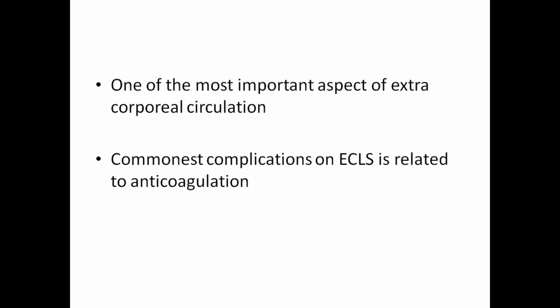And it's one of the most important aspects of the extracorporeal circulation. At the same time, if you're not careful enough, that can cause a lot of problems as well. And the commonest problems on ECMO are related to either over anticoagulation or under anticoagulation.